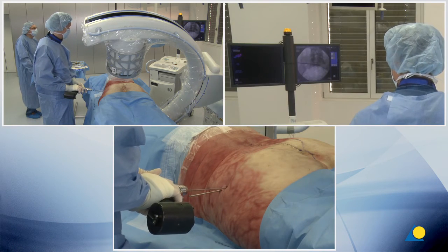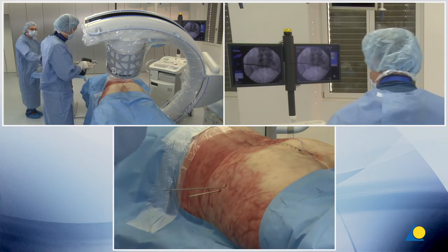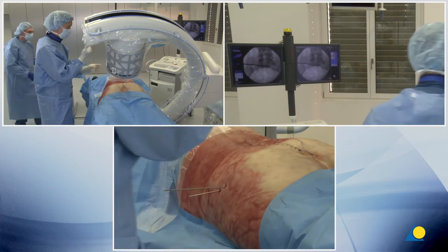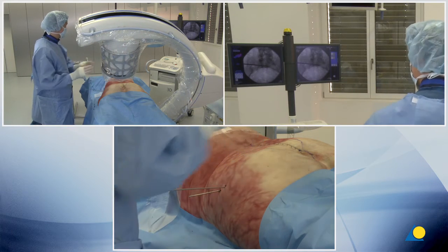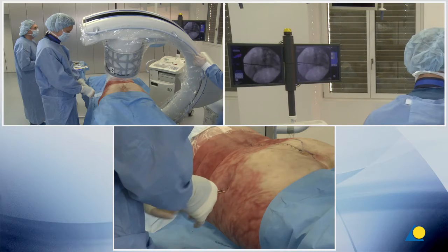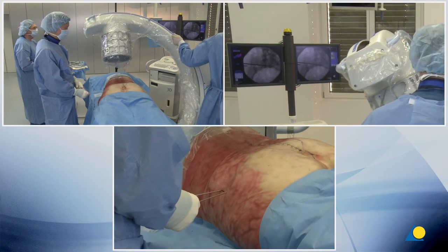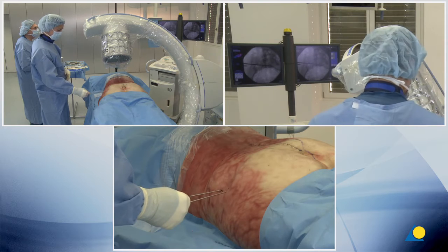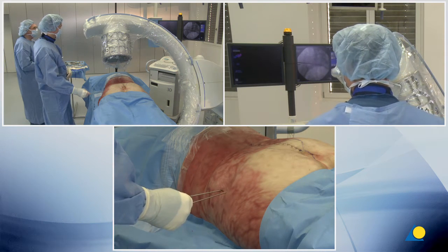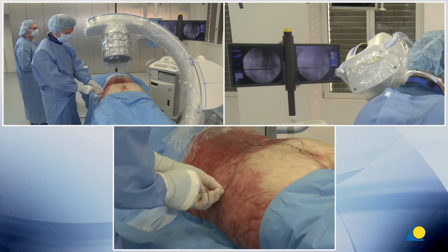Again, using the C-arm in the inlet and the outlet position, the guide wire will be positioned correctly on the outer table of the ilium. On the inlet view, the guide wire for a sacral fracture will be aimed directly across the sacral body, so it will be able to enter the ala on the opposite side.